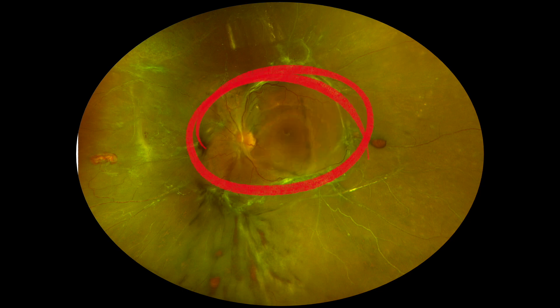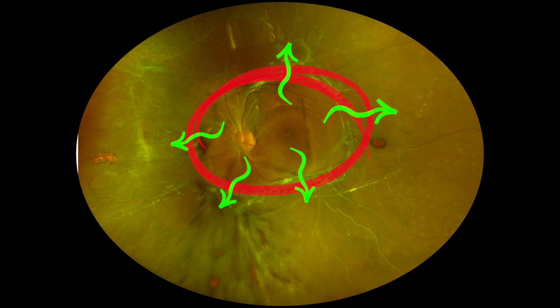Here's the surgical plan. The area of traction is outlined by the red color, and the aim is to cut into that area and segment, as well as delaminate without creating retinal breaks. If we can dissect the vitreous further out, it would be great because the vitreous is very adherent out till the periphery in this case.